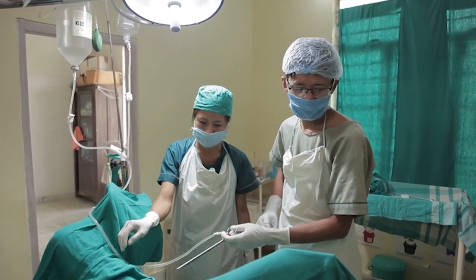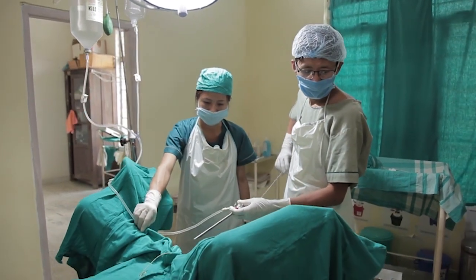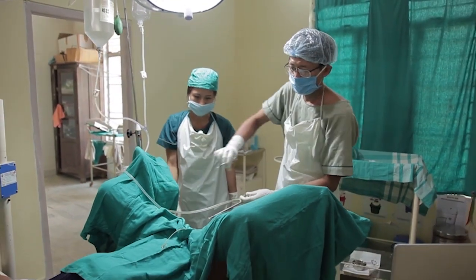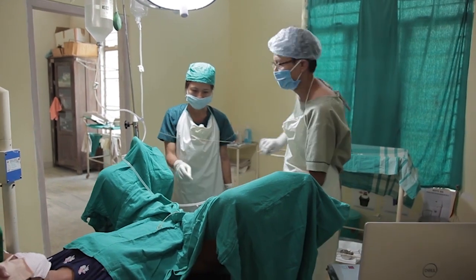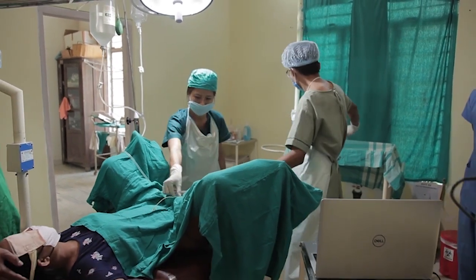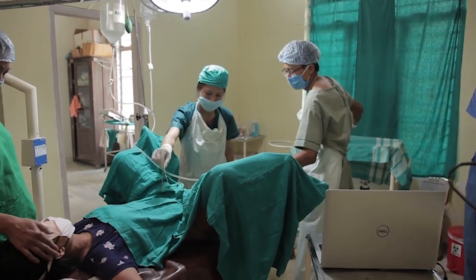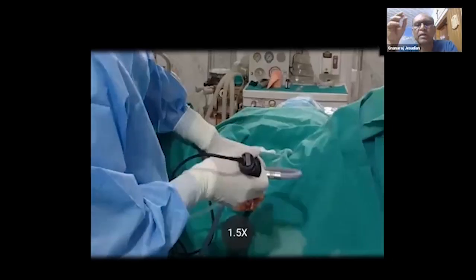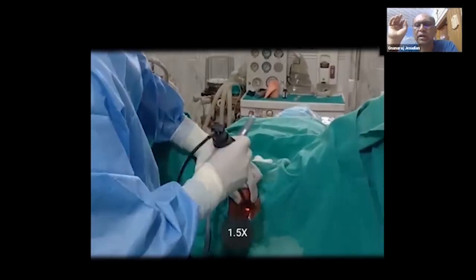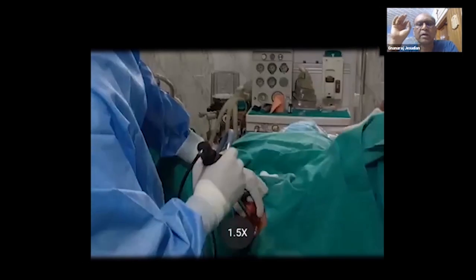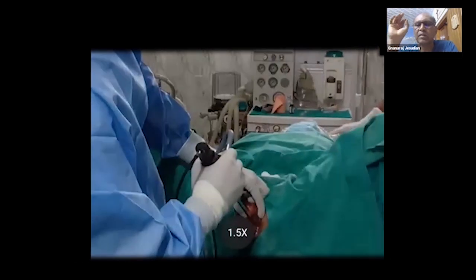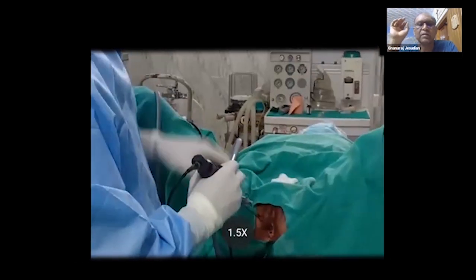The cost of the laptop cystoscope would be less than 1/20th of the traditional setup. If you are in a place with good internet connectivity, it is possible for experts to see your screen from a remote location and give you advice on what to do.